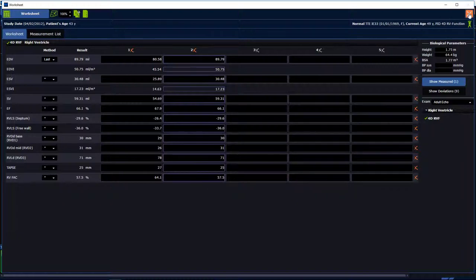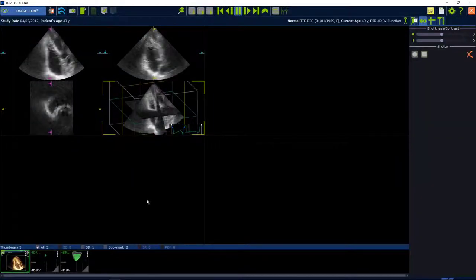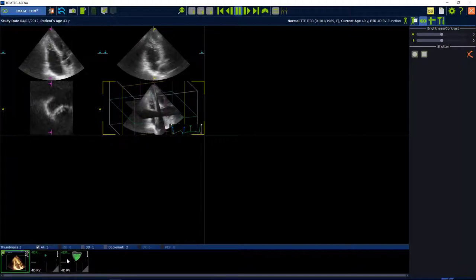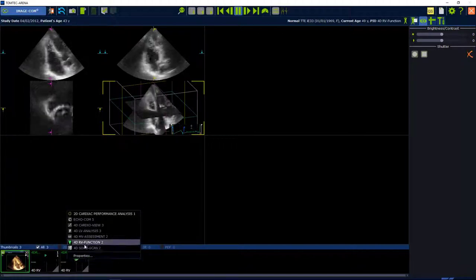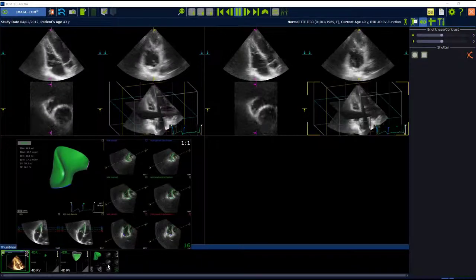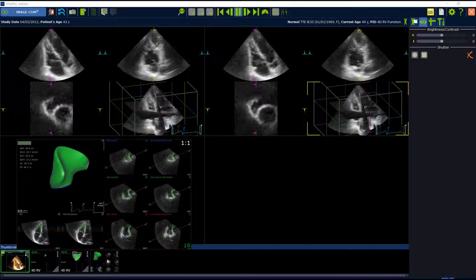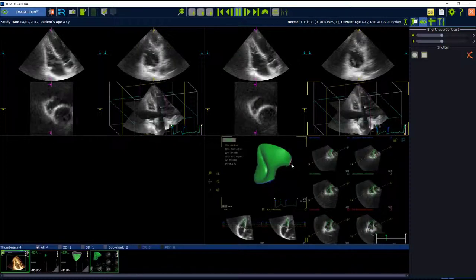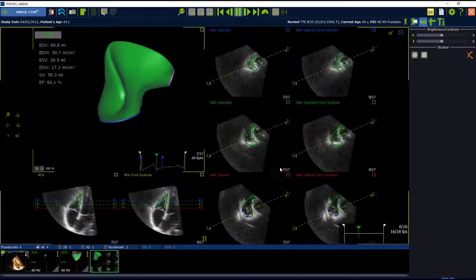In the thumbnail list next to the right, we can see the bookmark. Right mouse click on the bookmark to relaunch. Next to the right, you can see our secondary capture. Drag and drop to visualize.